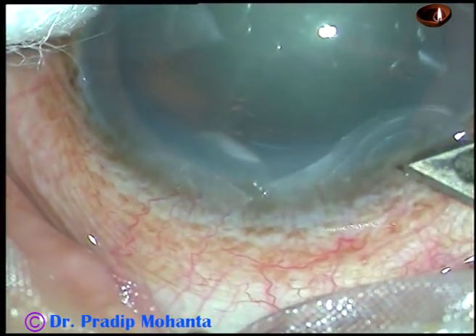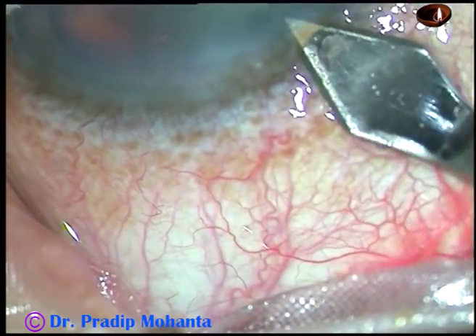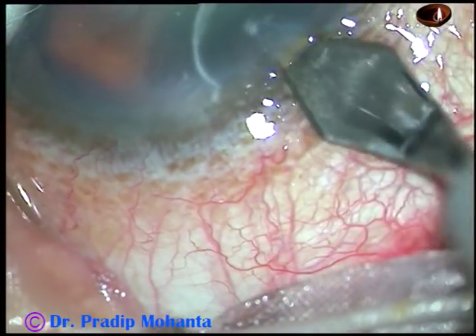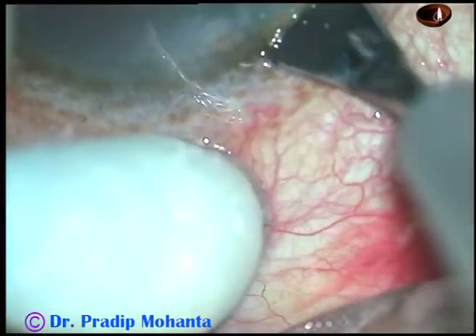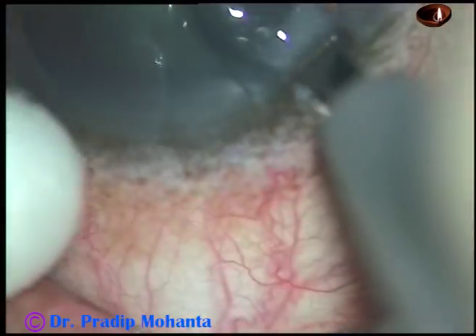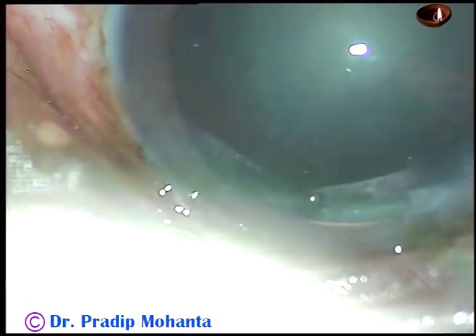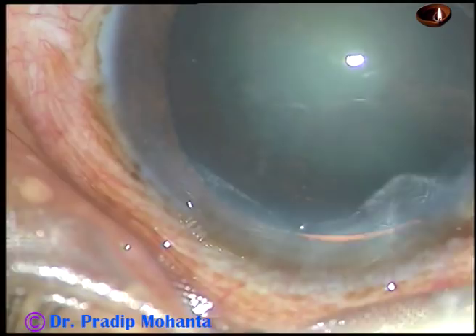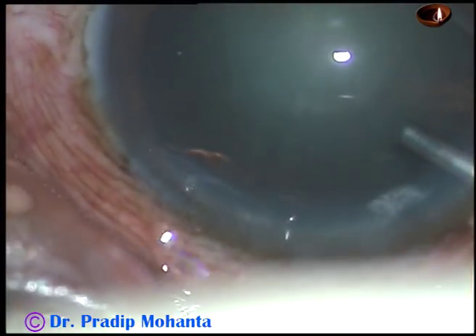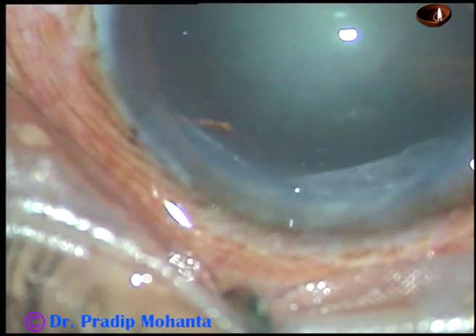This is a cataract with zonular dehiscence from 11 o'clock to 2 o'clock. I have taken up this case for surgery. There is a history of blunt trauma. And you can see in this view there is a red glow from periphery from 11 o'clock to 2 o'clock.